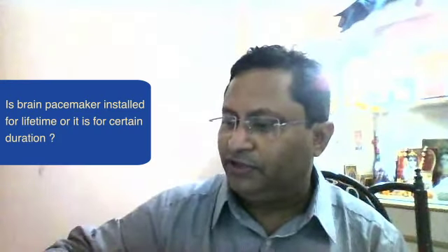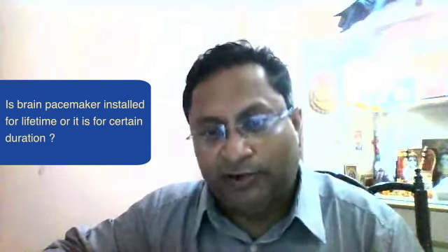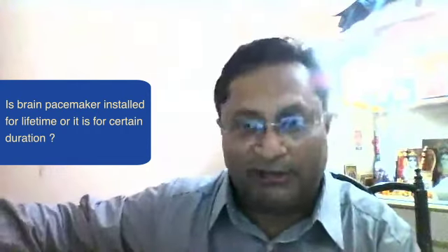Another question is, once a pacemaker is installed, is it for lifetime or for a certain duration? Yeah, it is for lifetime, but there are two types of brain pacemakers available. One is rechargeable, another is non-rechargeable. This is a non-rechargeable pacemaker, called Activa PC.